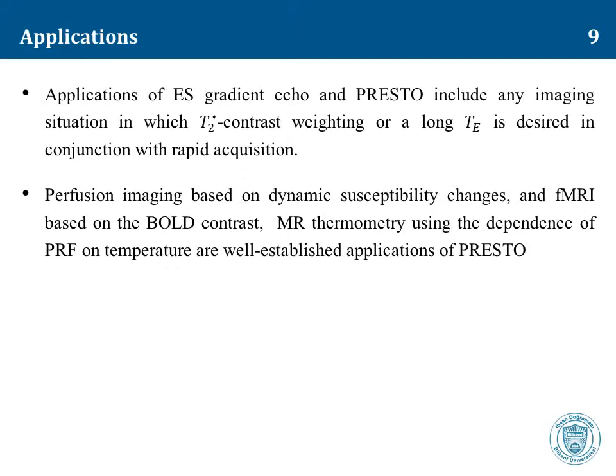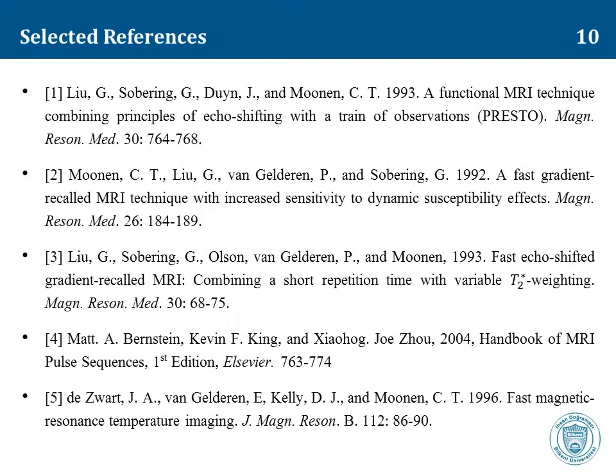PRF methods calculate a temperature difference map by forming a phase difference image based on acquisitions obtained at two different temperatures. These are the list of the references that I used for my presentation.